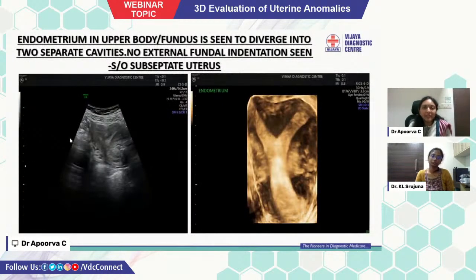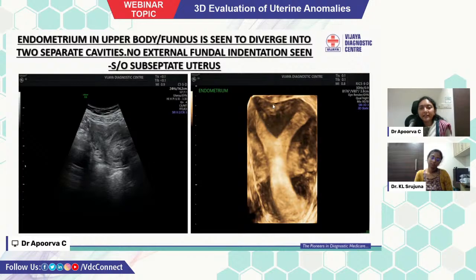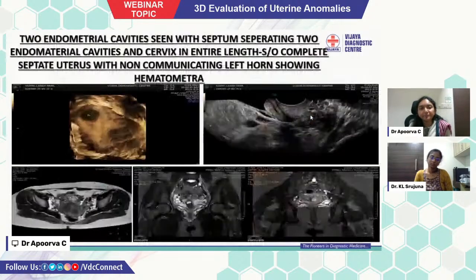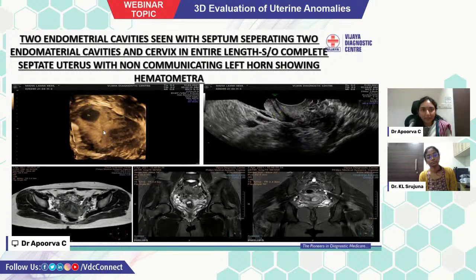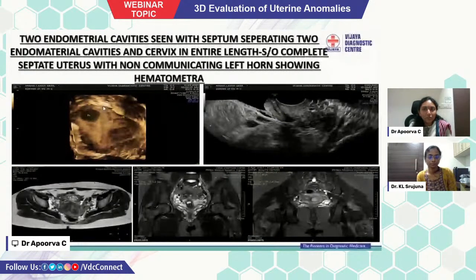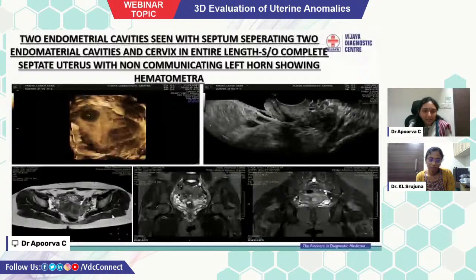This is another case showing a subseptate uterus — the endometrium in the upper body or fundus is seen to diverge into two cavities, with no external fundal indentation seen in this case. These images show a complete septate uterus, where two endometrial cavities are seen with a septum separating them including the cervix along the entire length, and there is a non-communicating left horn showing hematometra. The corresponding MRI images confirm the same findings: two uterine cavities, two cervical cavities, and hematometra.